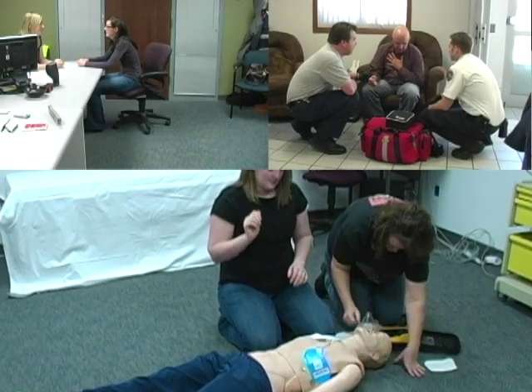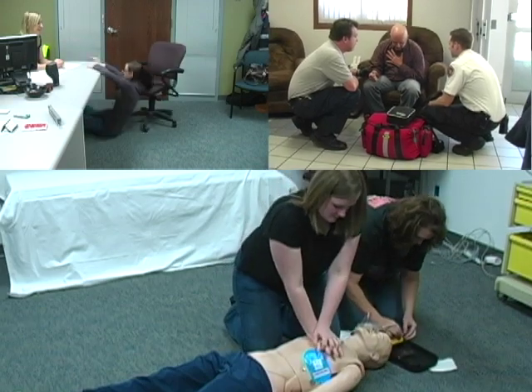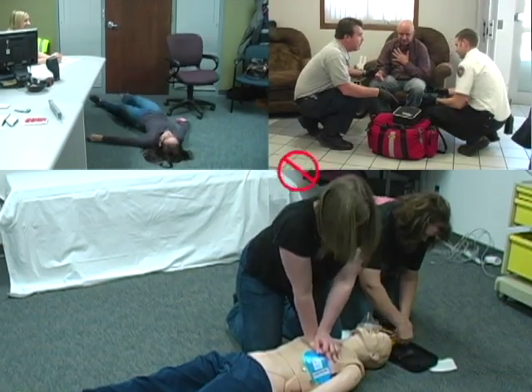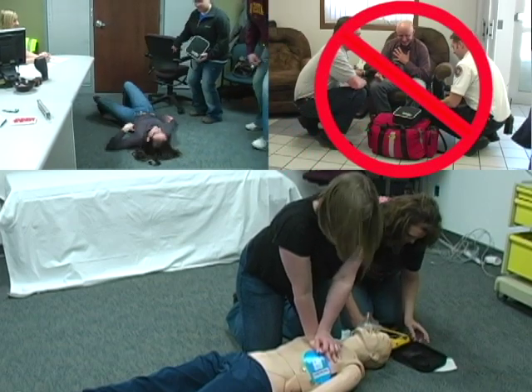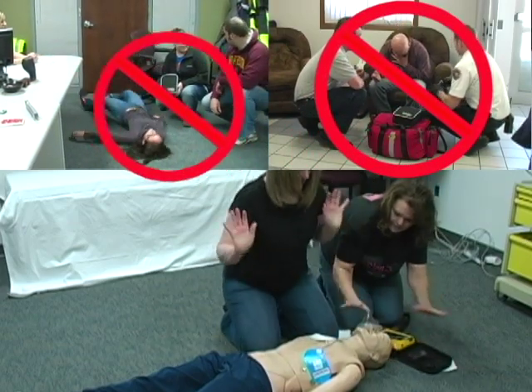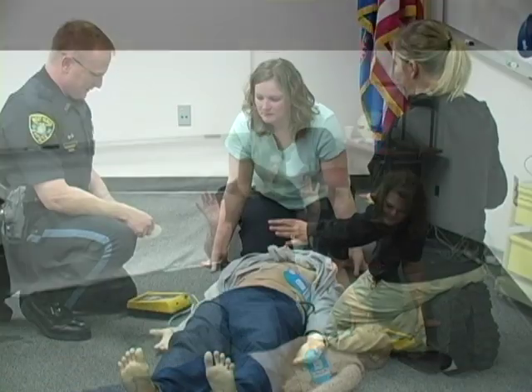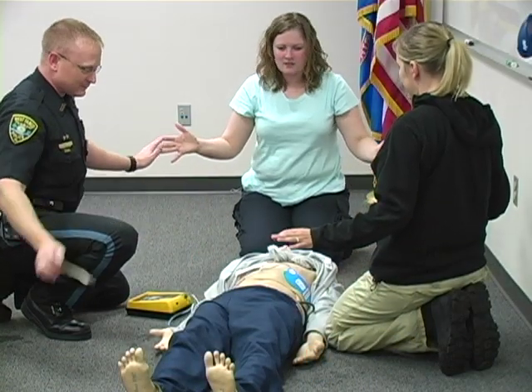AEDs should be applied to patients who are unresponsive and not breathing. They should not be applied to people who are awake, even if they have chest pain. They should not be applied to people that are having a seizure or other medical emergency. These people are still breathing. Your machine is not malfunctioning.